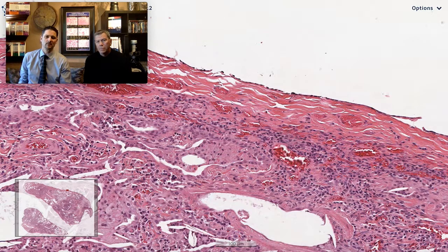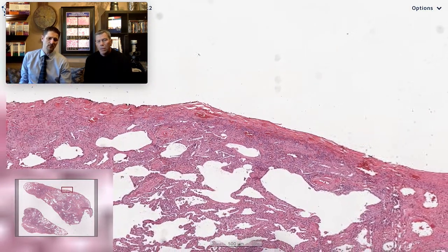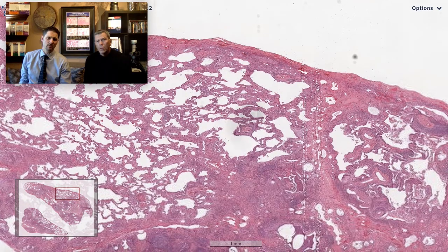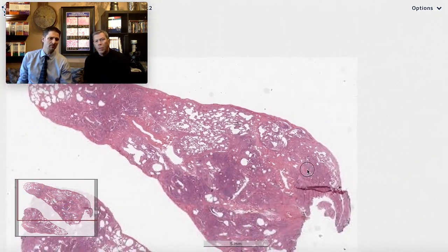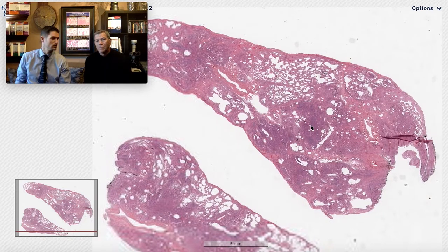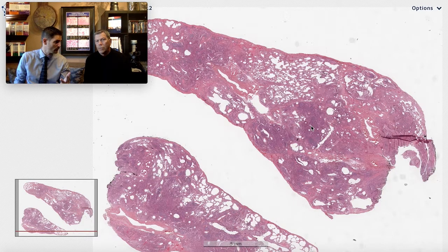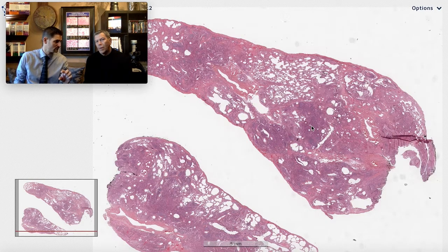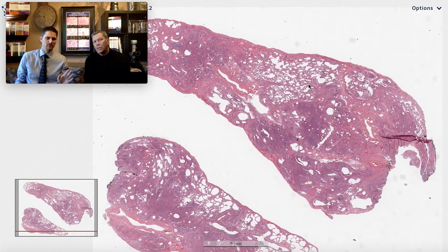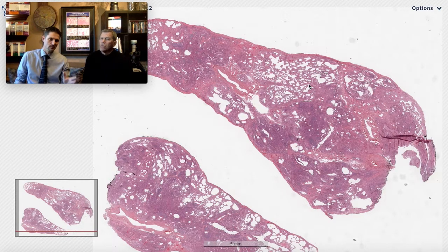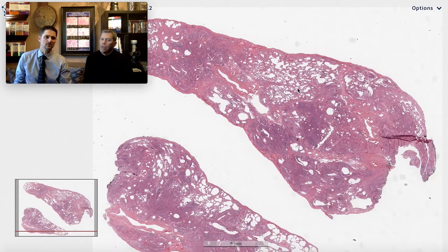Taking a step back and looking at this case overall: despite a low-power impression of heterogeneous UIP-pattern fibrosis, we have a female patient under 60, fibrosis with lymphoid hyperplasia, nodular aggregates of inflammatory cells, pleural thickening, and areas that look like NSIP. All of these features point away from the classic syndrome of UIP of IPF and toward connective tissue disease associated interstitial lung disease.